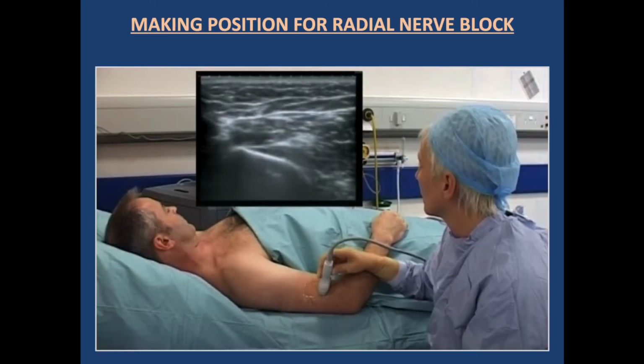This is a diagram showing the position of the radial nerve block. This is the commonest place where we put the block. This is the lower end of the arm, proximal to the lateral epicondyle, where the nerve is very clearly visible as a hyperechoic structure and very superficial, near to the skin. There is no accompanying artery or vessel, so it is usually easy to perform.